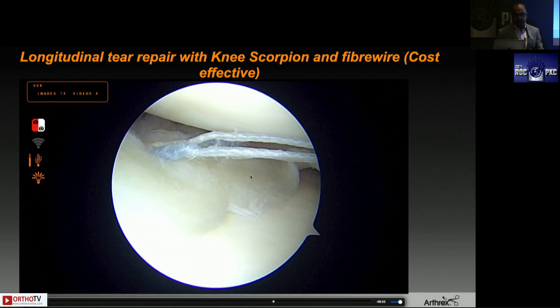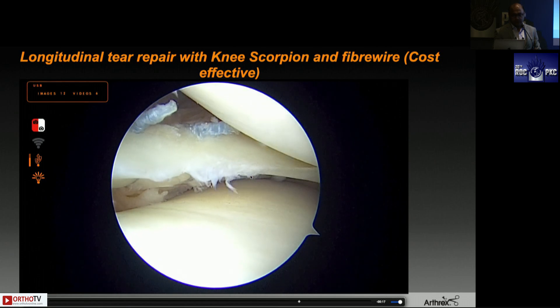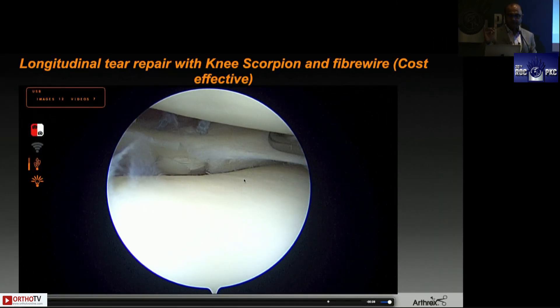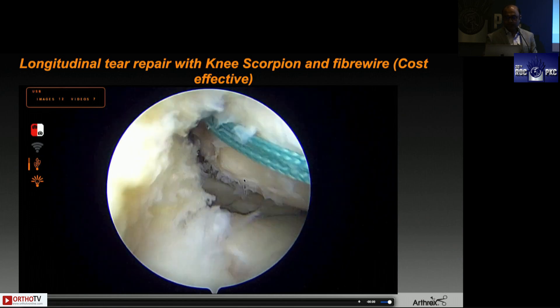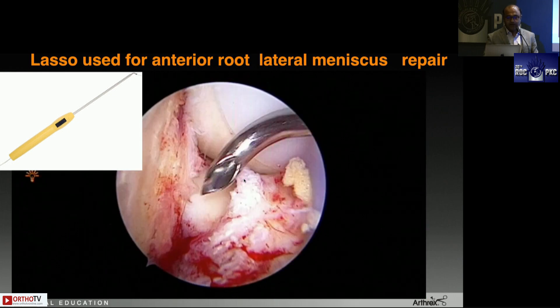A longitudinal tear can be tackled with multiple such sutures, and you get a nice robust construct. You can always put a fibrin clot, sandwiching it in the tear — especially if it is an isolated meniscus tear. We see such complex lateral meniscus tears in footballers and cricketers, in which case we usually put a fibrin clot. I've also included the lasso device because none of the other speakers today are covering it — the shoulder lassos are also very relevant for meniscus repairs.